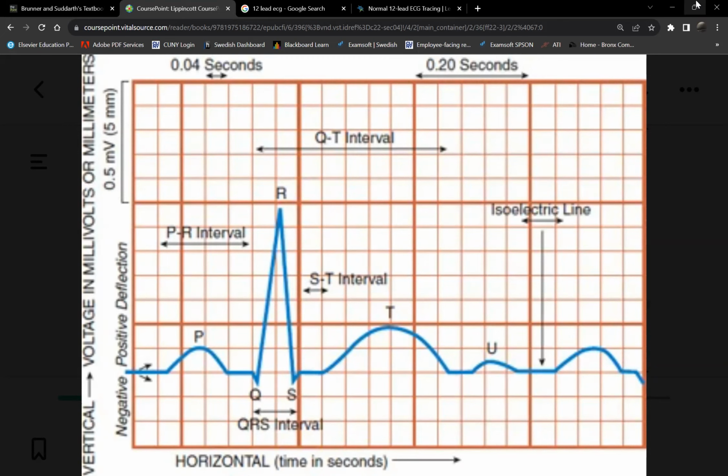You see PQRST. So therefore, if you have 60 to 100 beats per minute, and that's the appearance on the ECG, imagine what the PR interval will look like. If let's say someone's heartbeat is 200 beats per minute, will it look like this? No. What will happen to the PR interval? The higher the heart rate, the narrower or the shorter the PR interval will be.